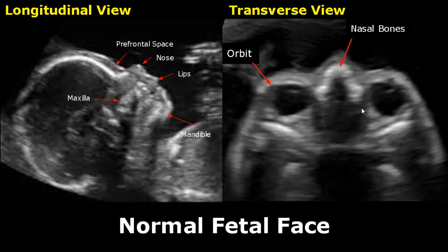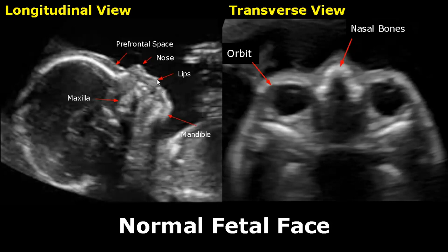These are longitudinal and transverse views of the fetal face. The sagittal facial profile is best for evaluating the face — we can see a lot of structures. Here is the prefrontal space in front of the frontal bone. This slanted hyperechoic line is the nasal bone, and here is the nose. You can see the upper and lower lips as well. This hyperechoic structure is the maxilla, and over here is the mandible.